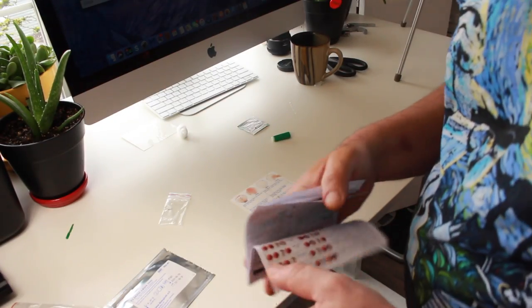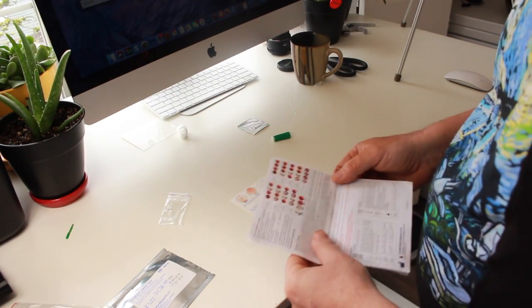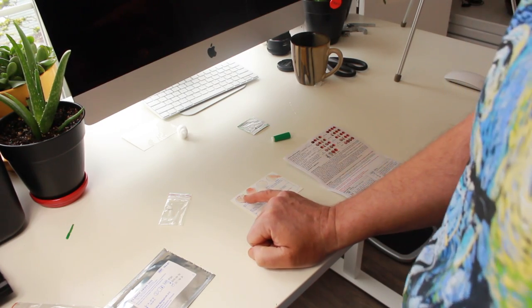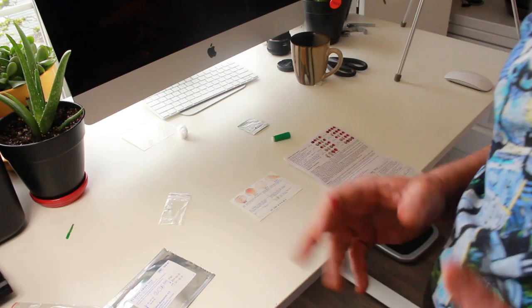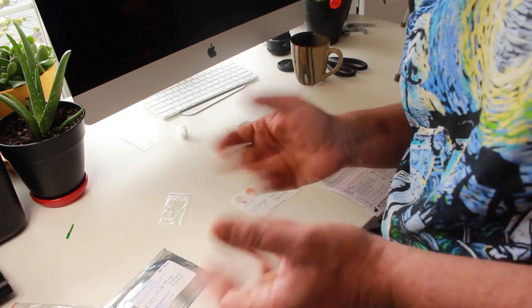Let's look at the cheat sheet here and see what it says. I had a reaction on this one and I didn't have a reaction on any of the other ones. So that makes me A negative.